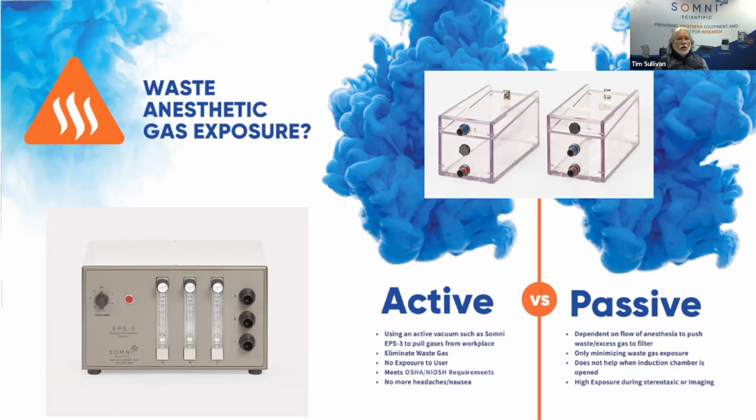The active chamber on the left-hand side has the same port feeding into the bottom of the chamber, but as you notice, the port is moved up above the lid, and what we do is actively draw away the anesthetic agent. So there's holes in the lid, so you're not building up any back pressure inside the chamber. It's escaping out through those holes and being drawn away by an active system of some kind.